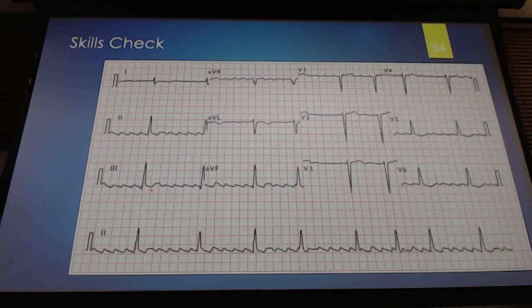Now, Blasic. Okay, what do we see here, sir? I see the saw teeth. Okay, so narrow complex, wide complex? Narrow, so narrow complex. We don't see a tachycardic ventricular rate, but we definitely see something in between those QRS complexes, right? Like you mentioned, we see sawtooth. Is it regular or irregular? Irregular. So we have irregular.